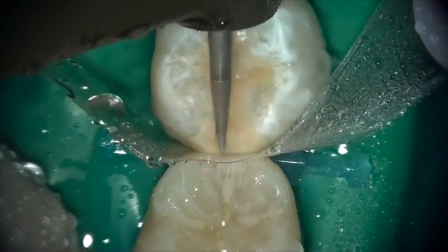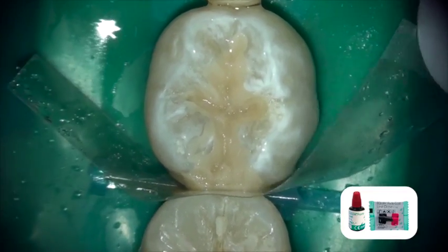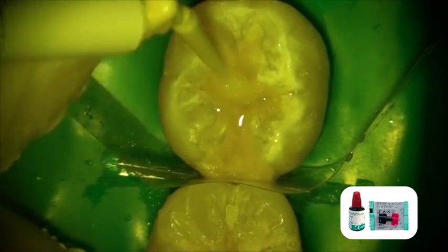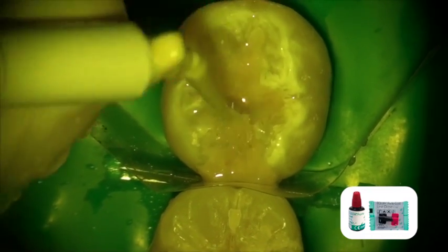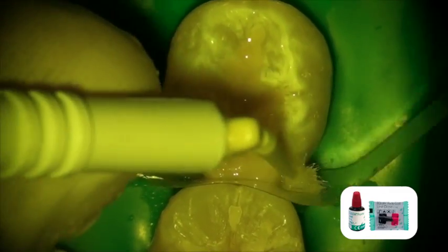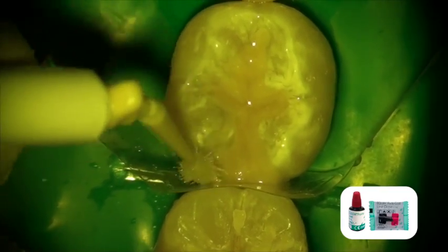There is also an optional Equia coat that is a light-cured protective layer. It adds surface strength to the restoration and tends to make the restoration slightly more color-adapting into the tooth. Although it is an optional step, I highly recommend you use it. It adds that finishing touch to your restoration and makes it absolutely spectacular.